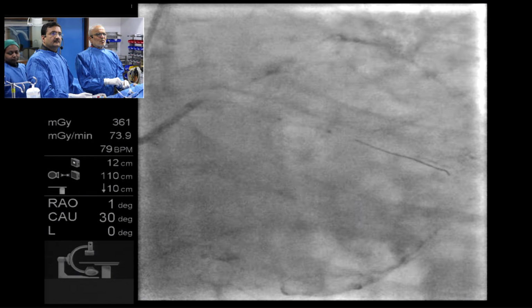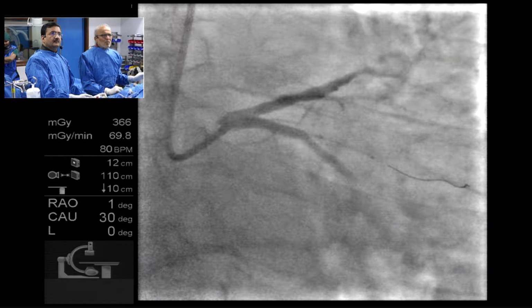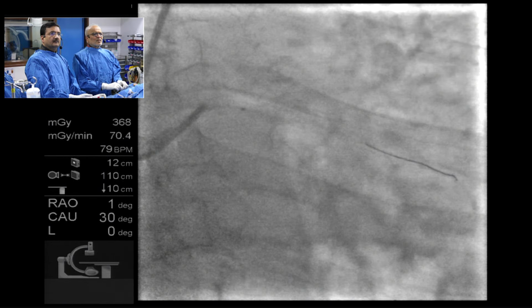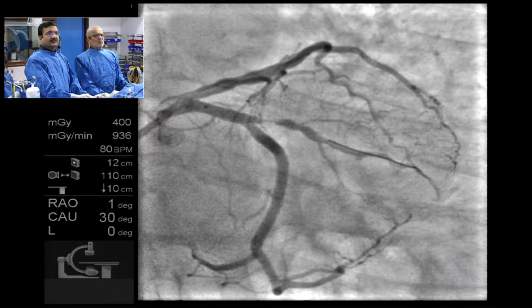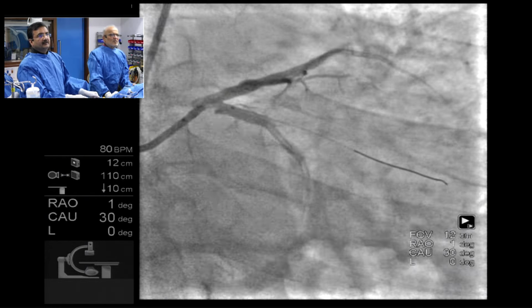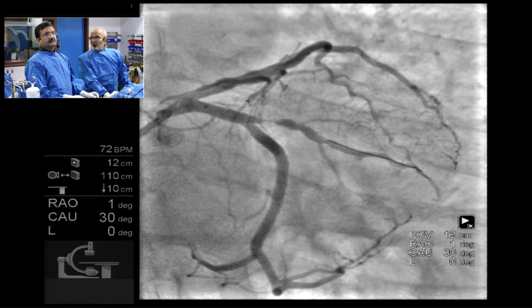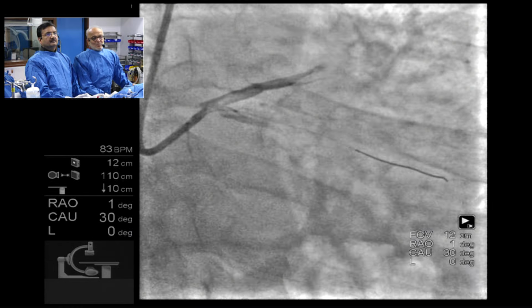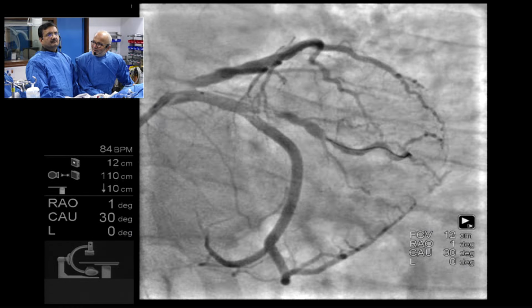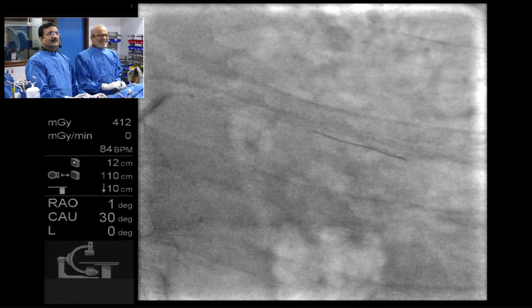Absolutely, that's great. Now if we pull it back out and take a picture, you probably see the whole circ. It looks great. It's a bigger one. So you're in the better branch. Professor Akasaka, do you think that we can have a good OCT image with this block, or we need to open it up? It might be better to open a little bit, yes.